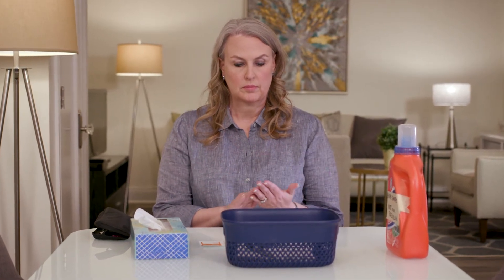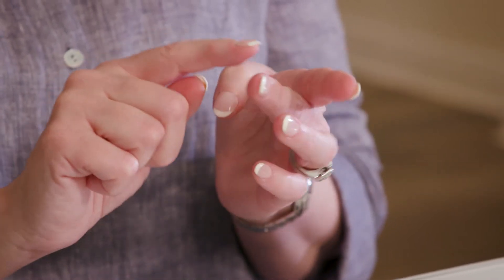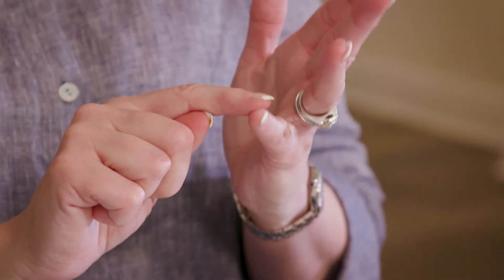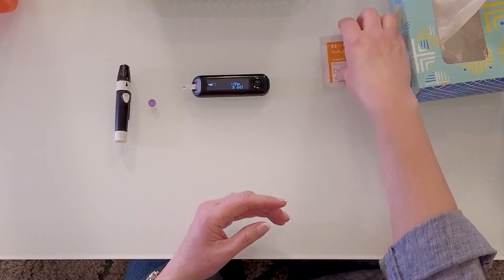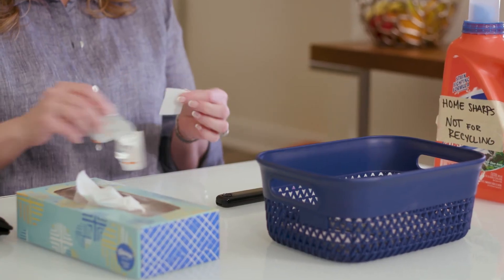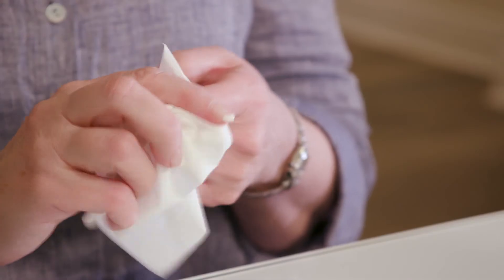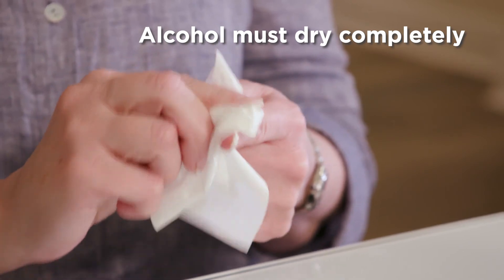Once your lancing device and blood glucose meter are ready, decide which finger you'll prick. You'll use the side of your finger, not the middle or tip where it's more sensitive. Make sure to change fingers each time and use both sides of your fingers to help prevent sore spots. If you weren't able to wash your hands with soap and water, clean the area you're going to prick with the alcohol pad and dry it with the clean tissue. Make sure the alcohol dries all the way. If any gets in the blood sample, your test result might be higher than your blood sugar really is.